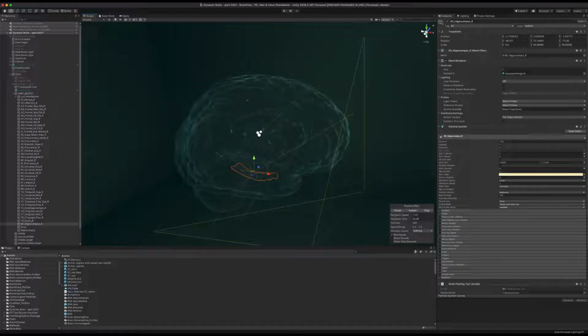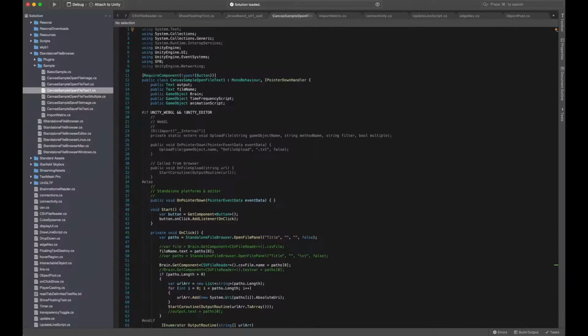How does it work then? Well, think of a very elaborate version of PowerPoint, but in a 3D environment. You can make or import 3D objects and then change all of their properties like shape, size, movement, color, and so on. For instance, you can make a 3D brain, divide it in regions and give the regions different properties. And best of all, you can base their behavior on your EEG data.